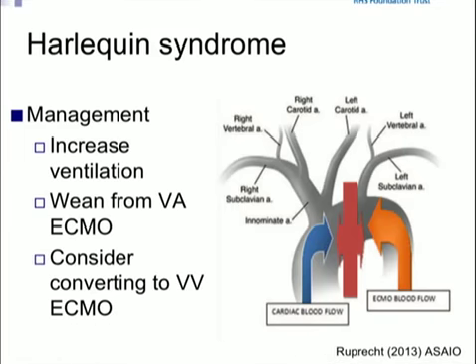We also need to think very carefully about our strategies for managing the improving heart. Particularly the Harlequin syndrome, where you've got heart ejecting deoxygenated blood because the lungs are yet to recover. Clearly, the first thing to do is to look at your increased ventilation. If that's not possible, you need to think about moving over to VV-ECMO.